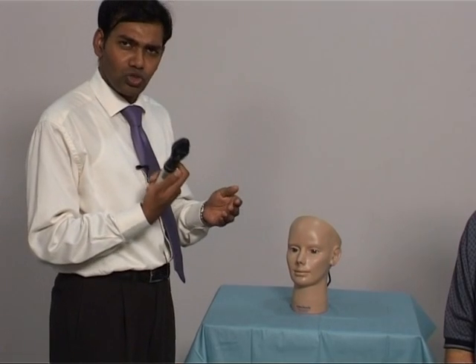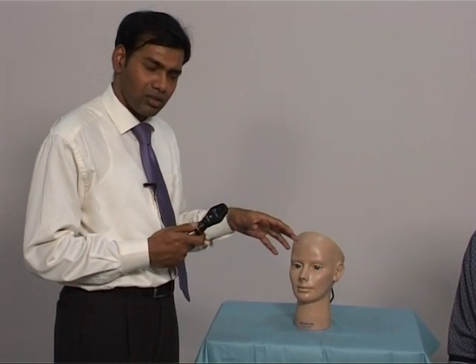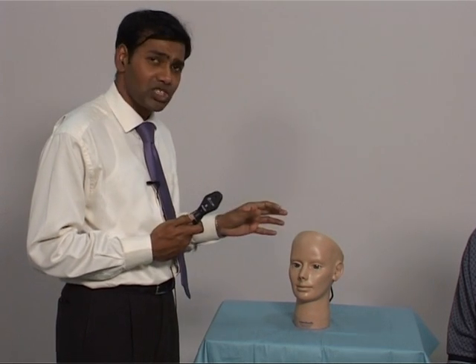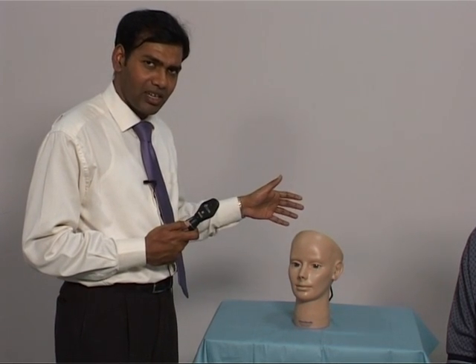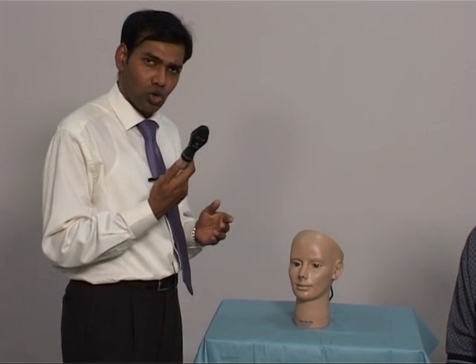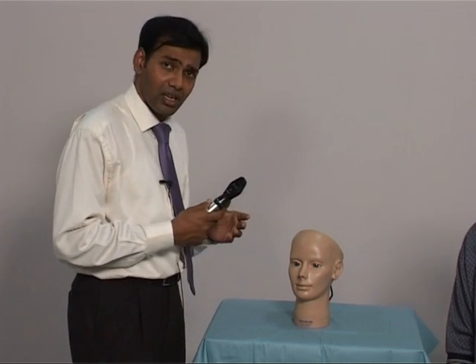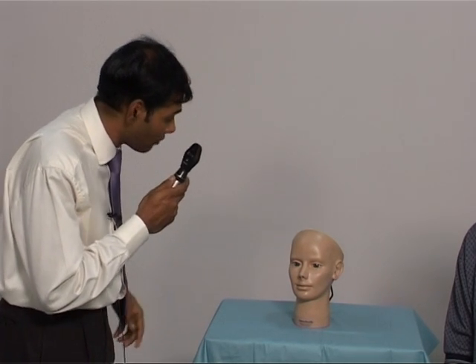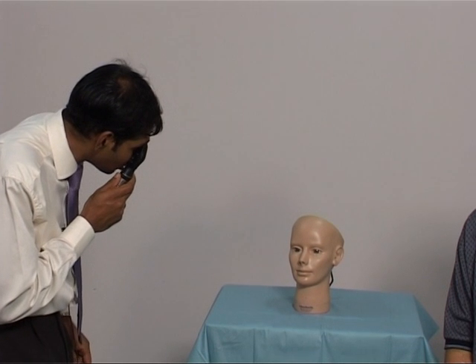And if you were to use the ophthalmoscope to examine the mannequin, the light source coming from the ophthalmoscope may often clash with this background light and will cause diffraction. And it may be sensible to switch it off and approach the mannequin using the ophthalmoscope with this light switched off. For example, you could do this.